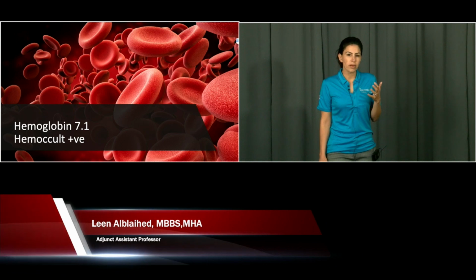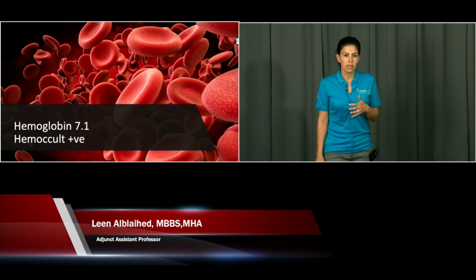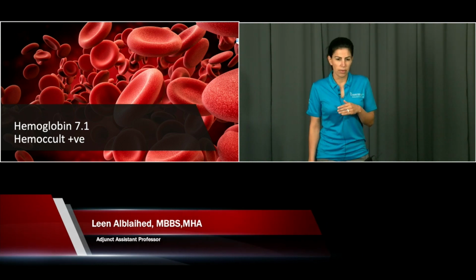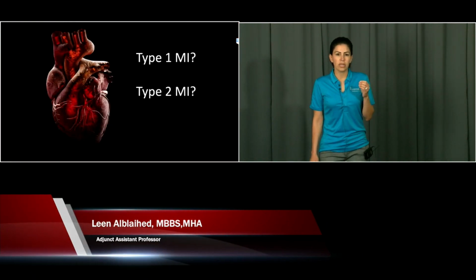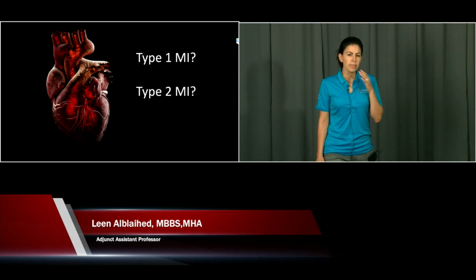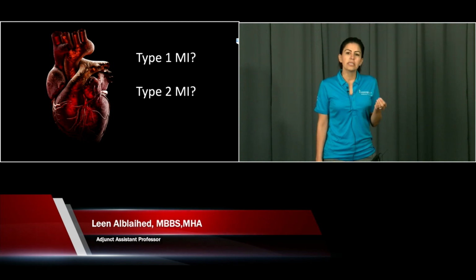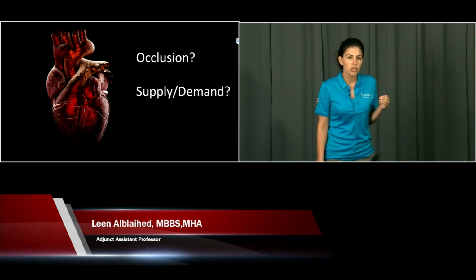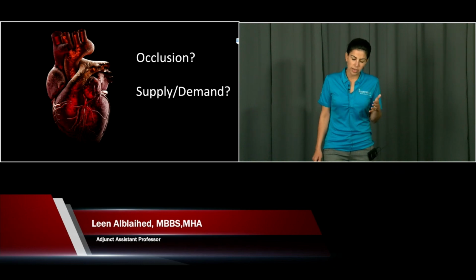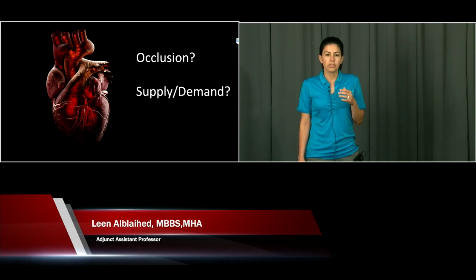And so now, if I call my cardiologist with my concern, what am I going to hear? Transfuse her, admit her, we'll see her again. It's subendocardial. It's not because of a STEMI, right? So my question when I was evaluating Rachel is, is she actually having a type 1 MI? Are these changes because she's actually having an MI versus is this type 2? Is this an occlusion that needs to go to cath lab? Or is she having a supply-demand issue where if I transfuse her and hike up her oxygen supply, she'll do good? So here's what I did.